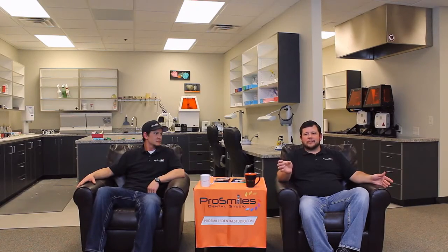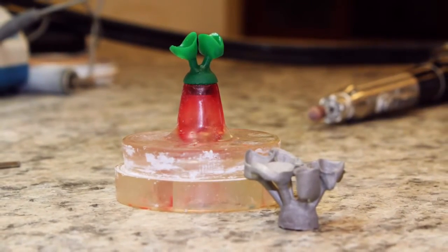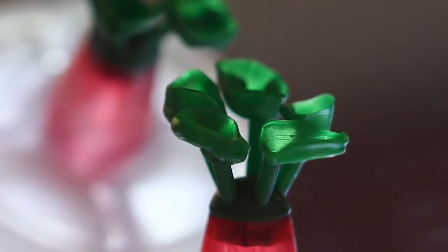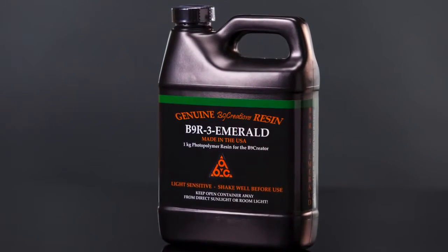When we first saw it, we just wanted to take it home that same day. We've outsourced, we've gotten models back, and we can't really tell much of a difference as far as dimensional stability. We've gotten models off of a quarter of a million dollar printers all the way down to a $5,000 printer, and there's really not a whole lot of difference.